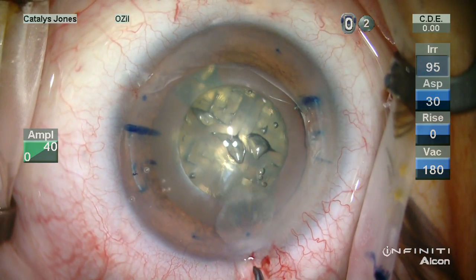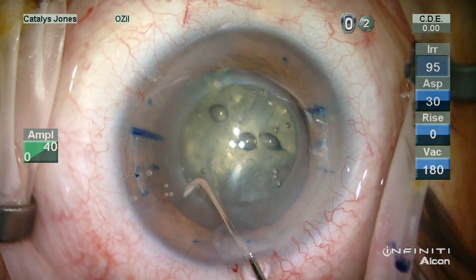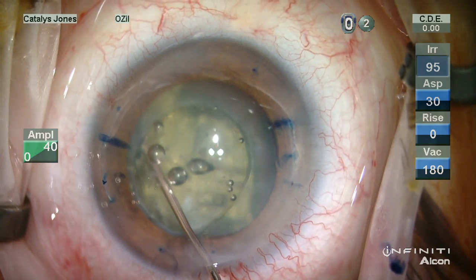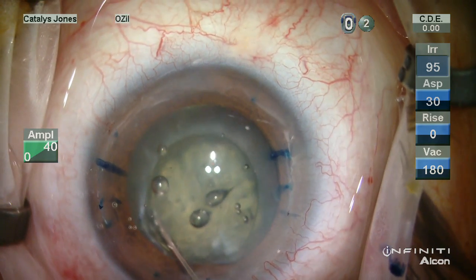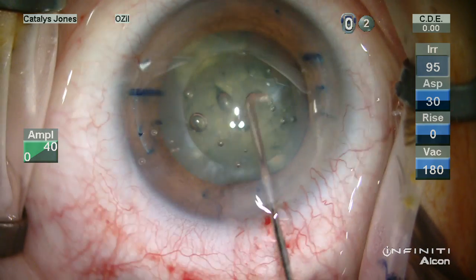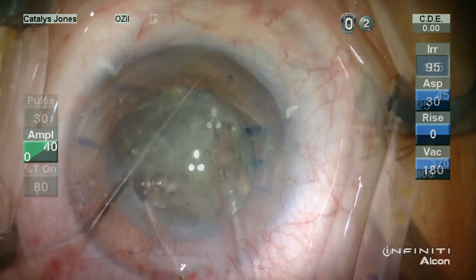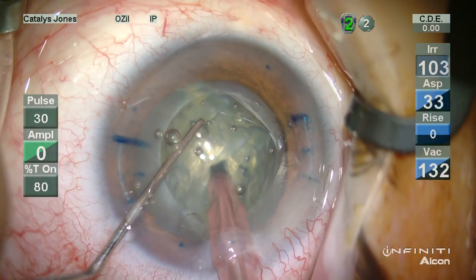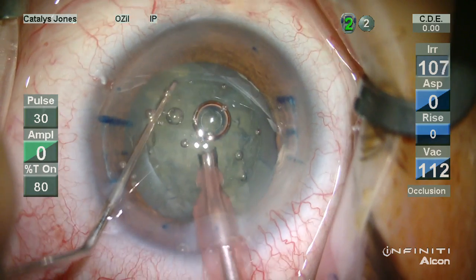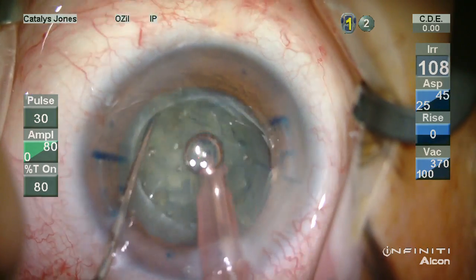Prior to removing it, gas bubbles are formed within the lens substance. However, none wanted to migrate forward without any hydrodissection, and even once a hydrodissection wave had been created, this rather large bubble still did not want to present itself. As the lens is manipulated, the gas does come forward.